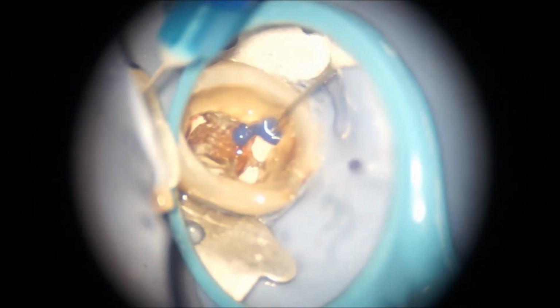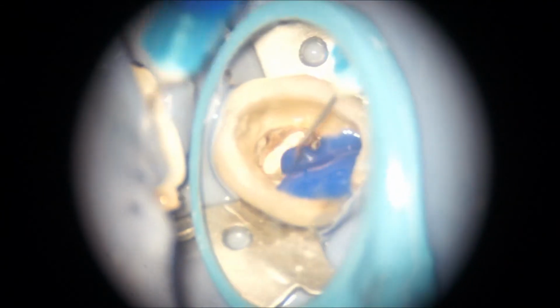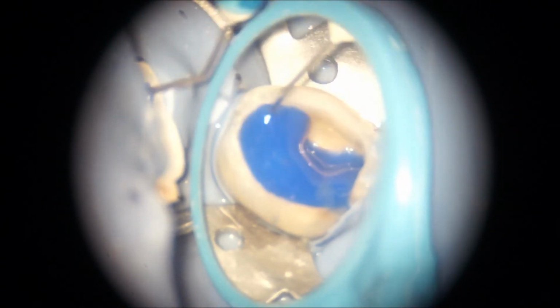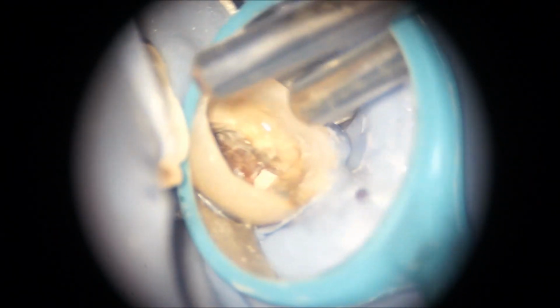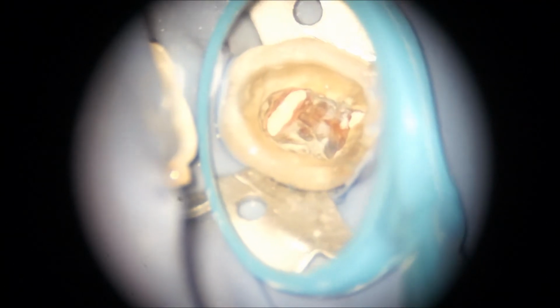Long-term exposure to Eugenol might have a detrimental effect on the bonding of the composite materials that we use as a core. I would have loved to use the composite materials because of their strength and because they are so easy to use, but in the end I opted for a glass ionomer in the form of Chemfil Rock from Dentsply to fill out the tooth and create a core onto which we can bond the crown.